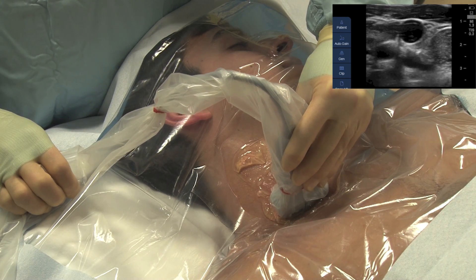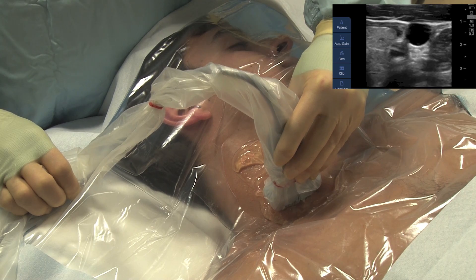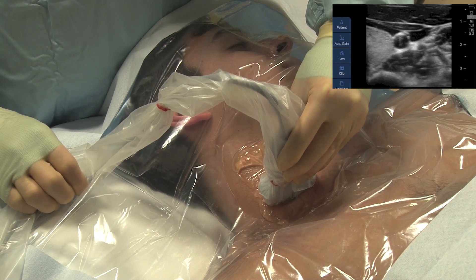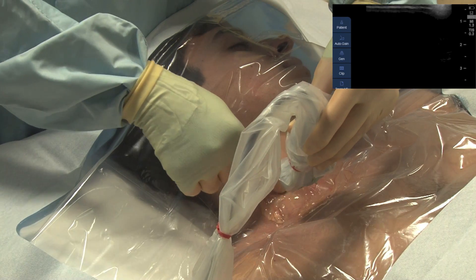Confirm that the vein is patent all the way down to the junction of the internal jugular with the subclavian. Identify the desired point of needle insertion at the two heads of the sternocleidomastoid muscle.